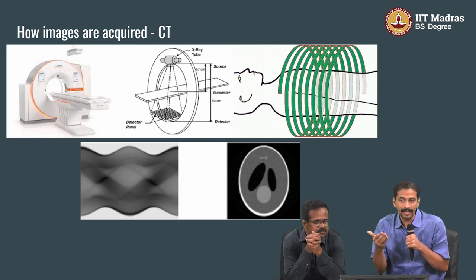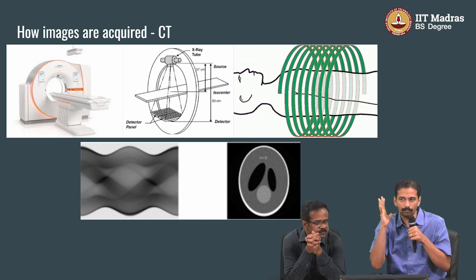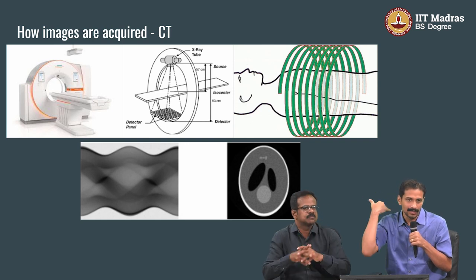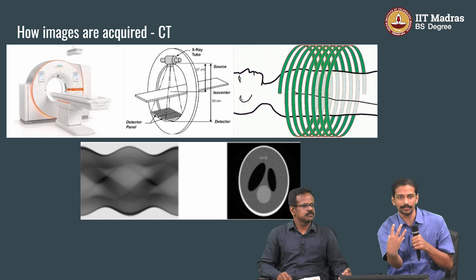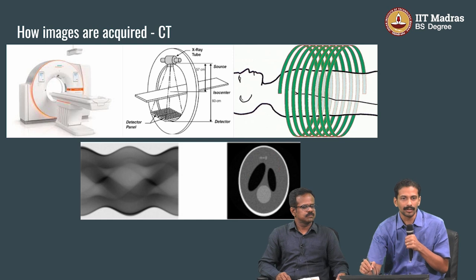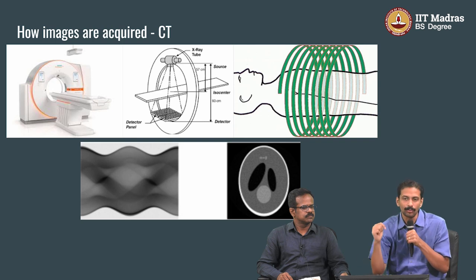But what happens in CT is that the axis is being changed. We are cutting multiple sections. We have covered the entire volume and collected the entire volume of data. Now slice that volume, right? Slice this and see it like this, in front of you. That is the idea. If you look at this particular image, you will understand what I'm saying. This particular slice is at the level of here. You cut it across here, open it and see it, and the image will look like this.